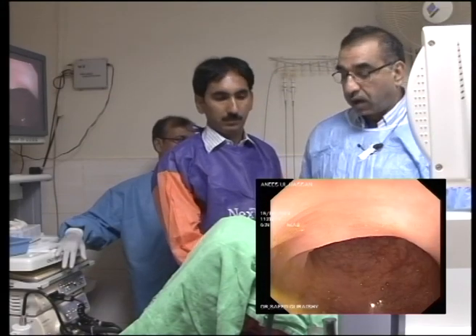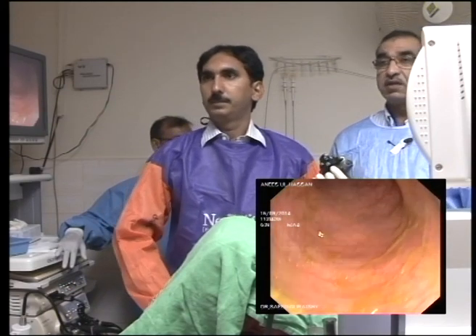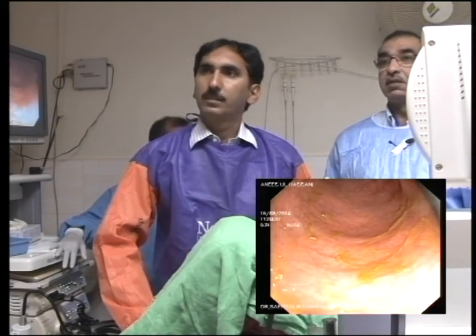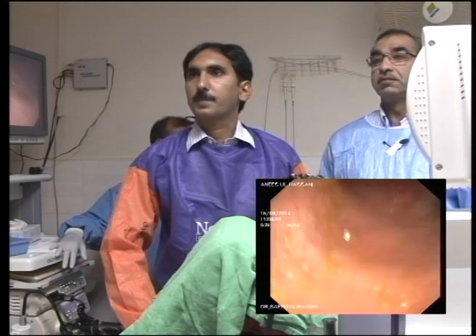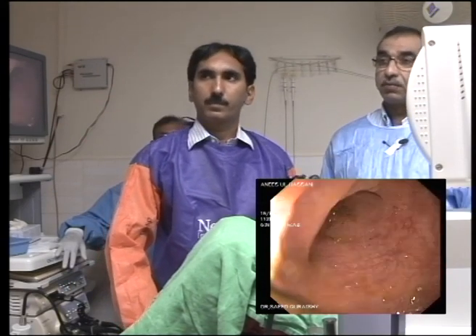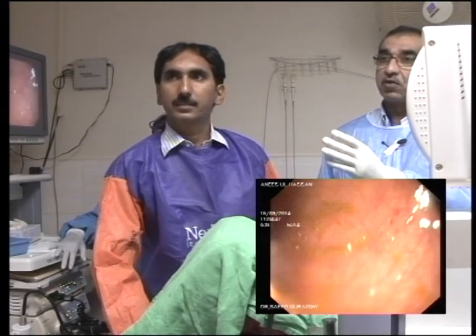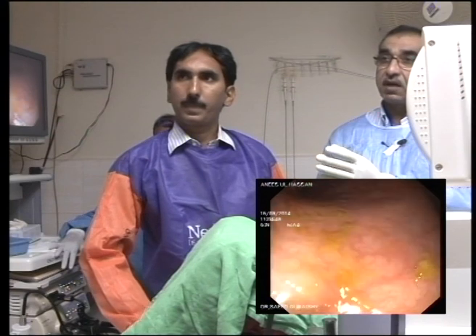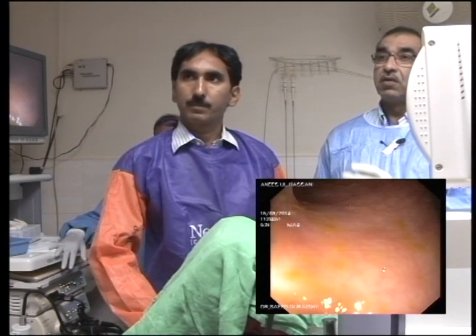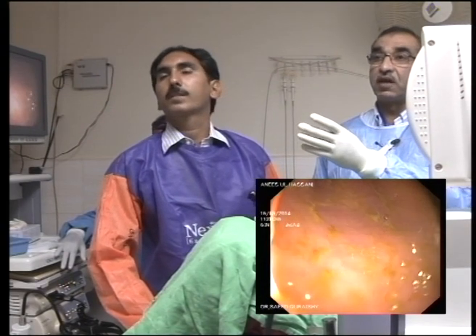Okay. You take over. Okay, now you advance. Okay, gently. Now just point down, clockwise rotation. Yeah, slightly anti-clockwise now. Just, yep, and advance. Now, lumen view, full luminal view. No, don't, yeah, skip. Okay, that's fine.